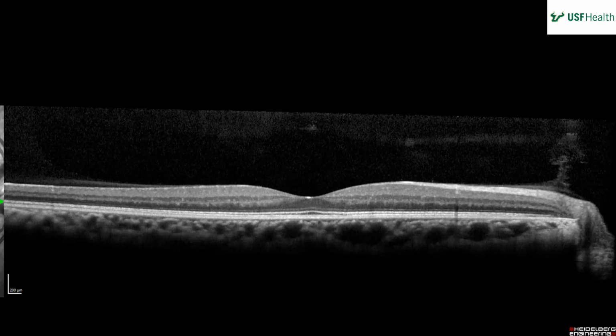Okay, this is OCT of the right eye. Pretty much normal foveal contour. Media on top looks fine, except around the nerve area. You can see some of that vitreous or fibrous material attached there. Doesn't look like it's pulling any traction. Otherwise, looks pretty much grossly normal.